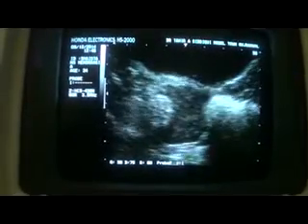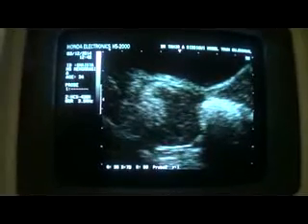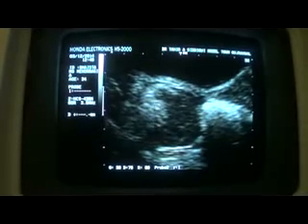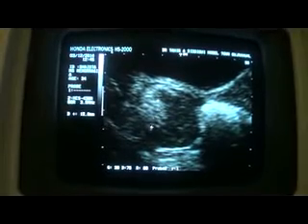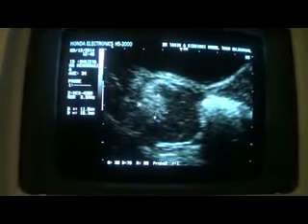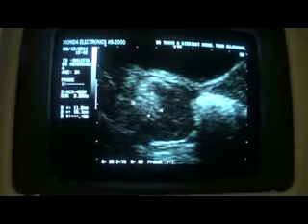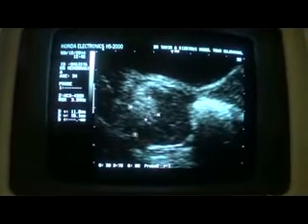Well, this is the cystic mass. And echogenic area. This is the dense coarse echogenic area with a few tubular hypoechoic areas within it, measuring approximately 15 by 11 mm, and we do not see any calcification within it. And this is the anterior wall of the cystic mass. No posterior wall acoustic enhancement is seen.